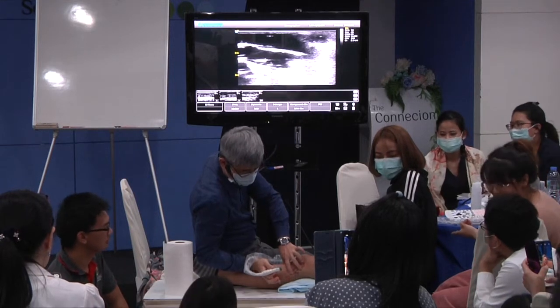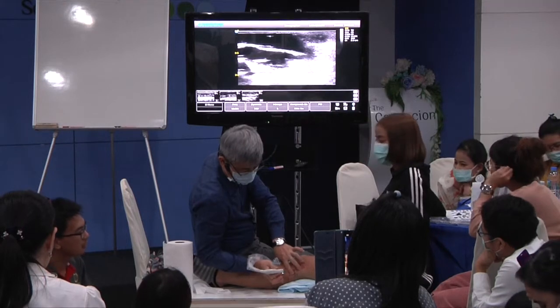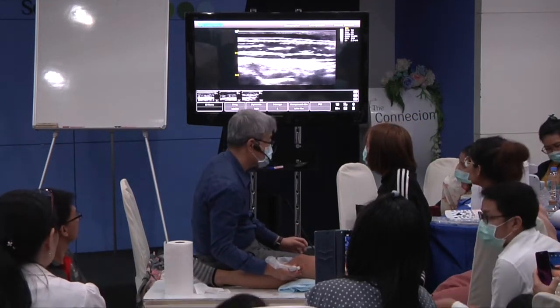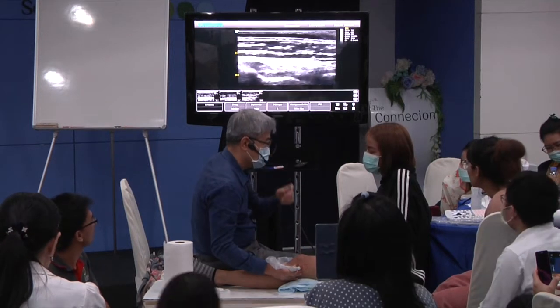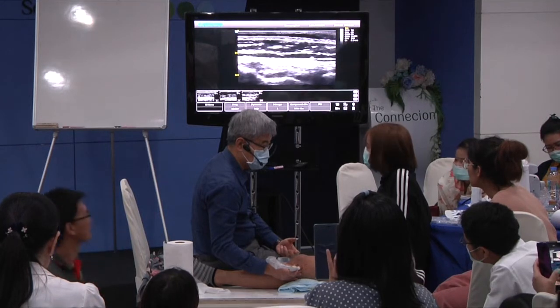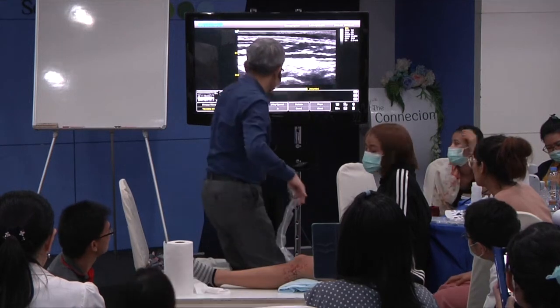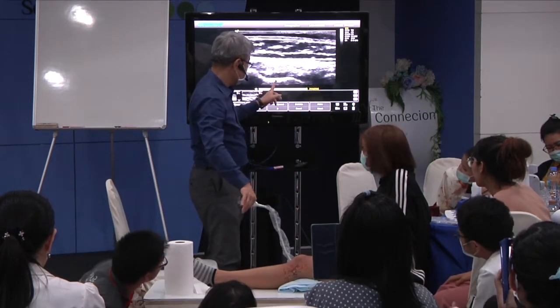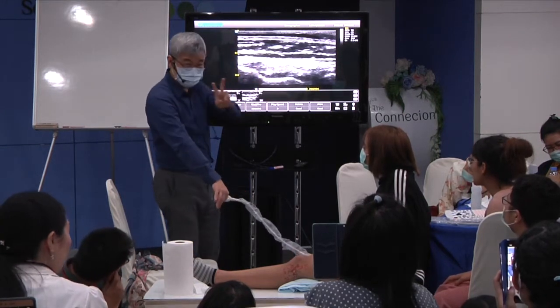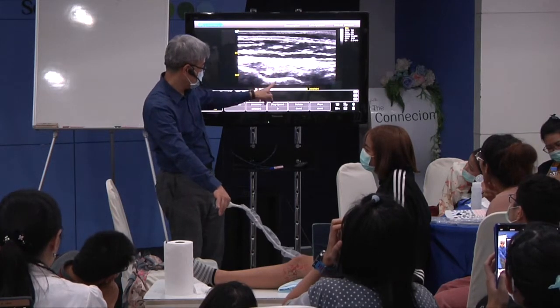Find the lateral condyle. Find the fibular head. See? Two-second job. Popliteal sulcus, please. LCL, the structures above, please.